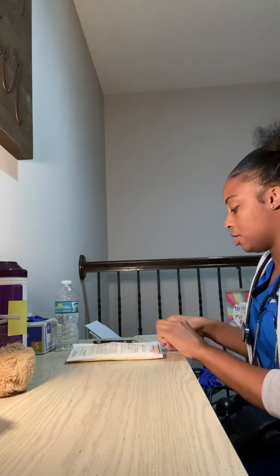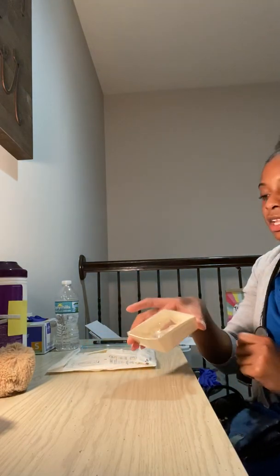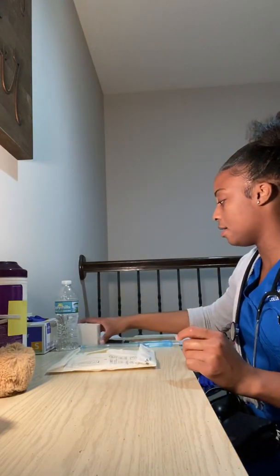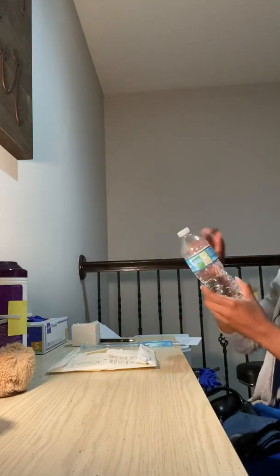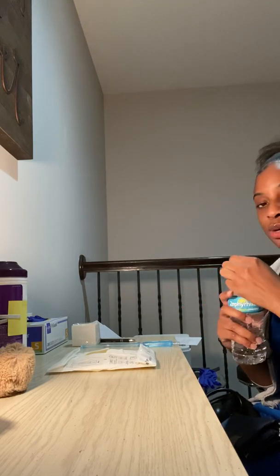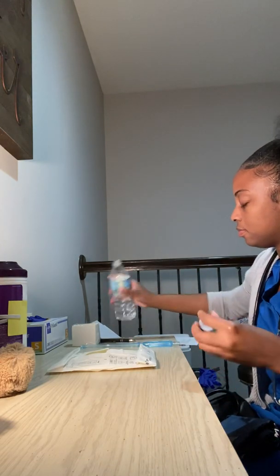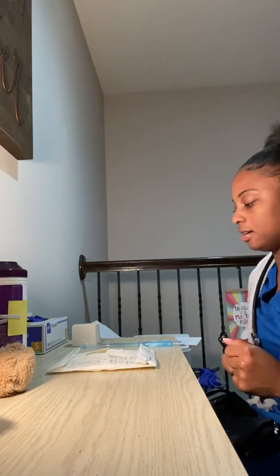Okay, I'm gonna open up my sterile kit here. I can go ahead and open up the box, leaving the paper on the inside. And I'm gonna leave that right here, so that I'm not reaching across over there. I'm going to check the expiration date of my sterile water. I'm gonna be the first person opening it and using it today, so I don't need to lip it. Expiration date says 2022, so we're good to go ahead and use it. I'm gonna pour some here. Okay, and then I'm gonna put that off to the side. I can also put that off to the side.